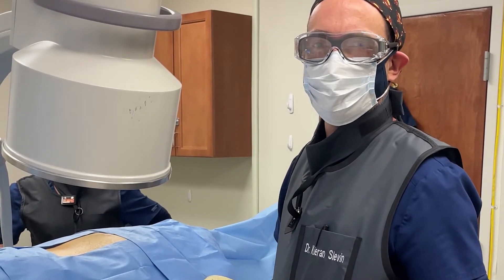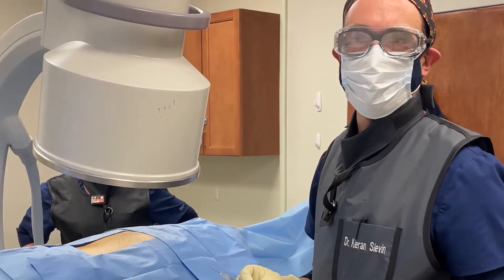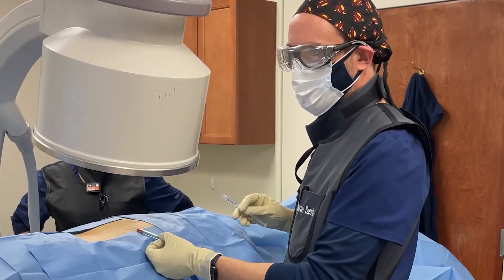Good morning, my name is Dr. Ciaran Slavin from North American Spine and Pain. We're here to talk about a lumbar radiofrequency neurotomy procedure, which the patient has kindly agreed to allow us to film for educational purposes.